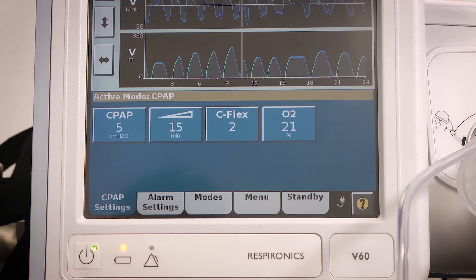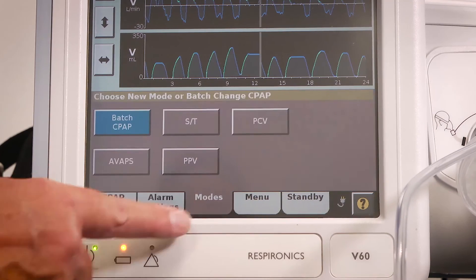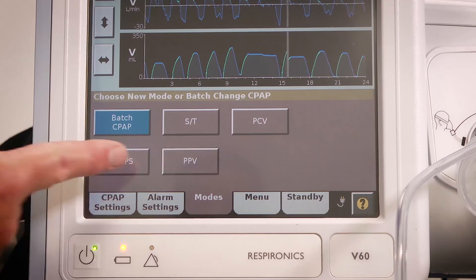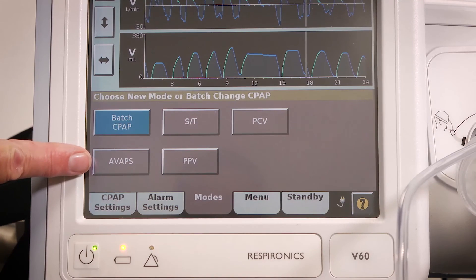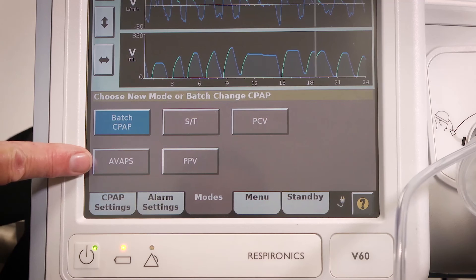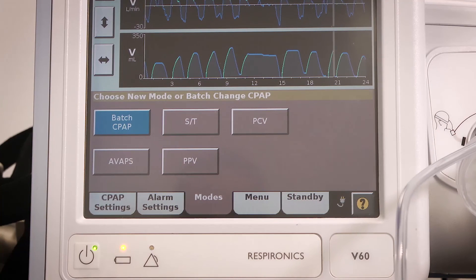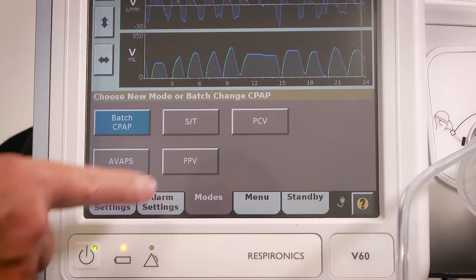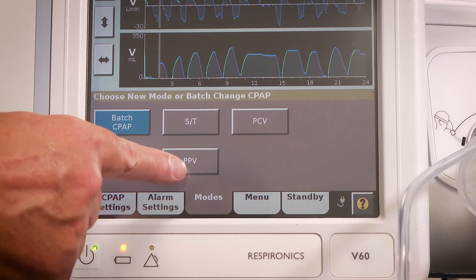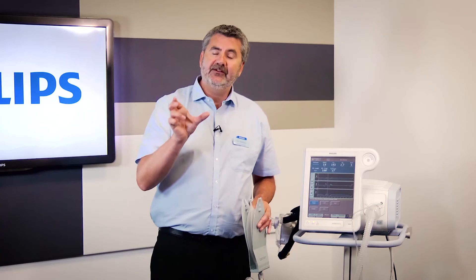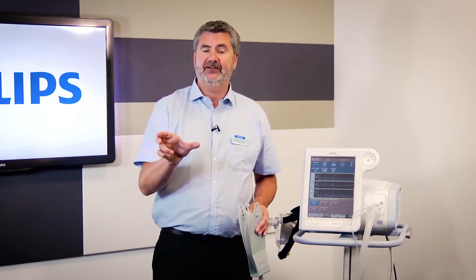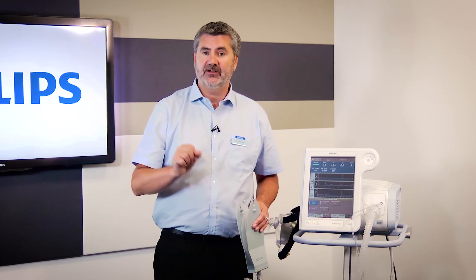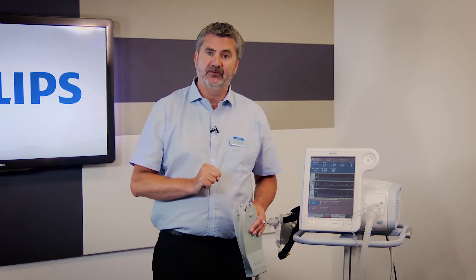Finally, there are other modes available on the V60: pressure control ventilation, averaged volume assured pressure support — a volume mode that still uses pressure support — and proportional pressure ventilation. These are more detailed and are better explored in the handbook or by asking your local representative to explain them further.